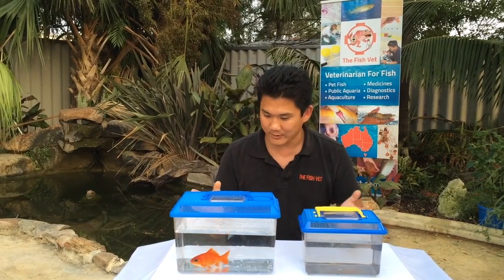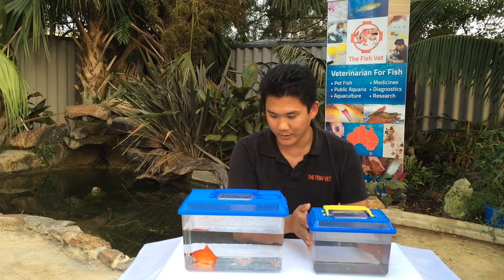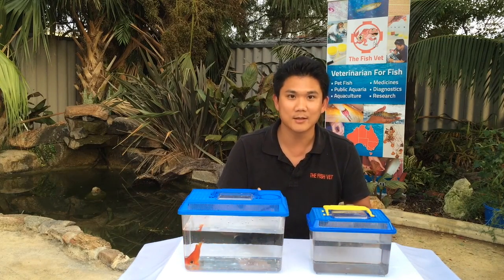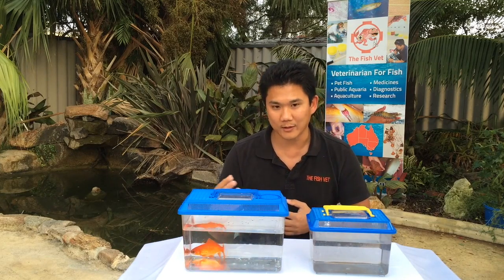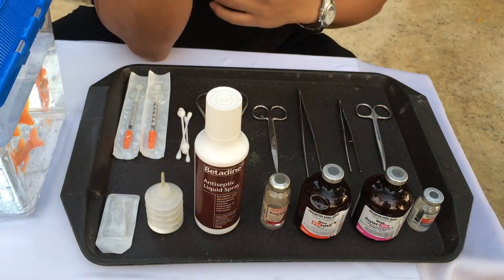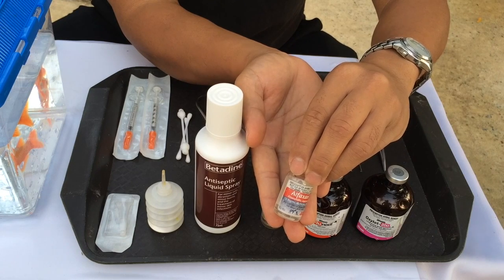I'm going to talk you through the process. We're going to anaesthetize the fish in an anaesthetic solution. Here we're going to be using alfaxalone, which is a dog and cat anaesthetic. After we've got him suitably anaesthetized, we'll go through the whole procedure and I'll be talking you through what I do and the pitfalls to look for as we proceed. Here we've got a tray full of all the equipment and medicine we need. This is the alfaxalone which we'll be using to anaesthetize the fish.